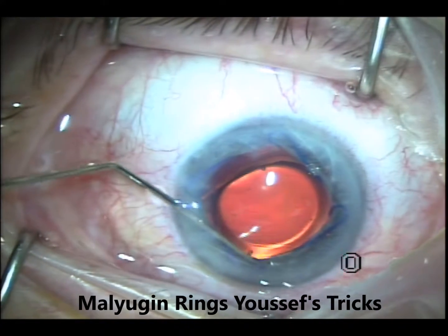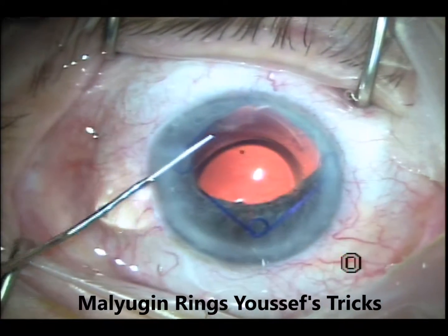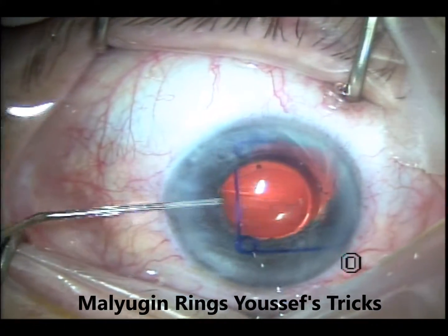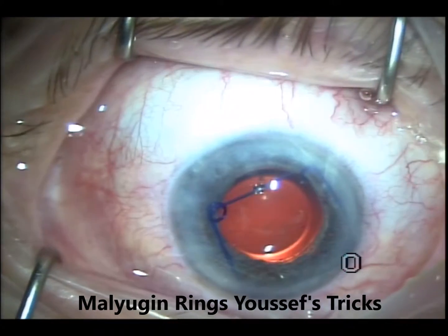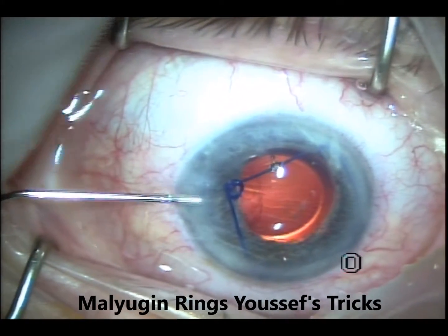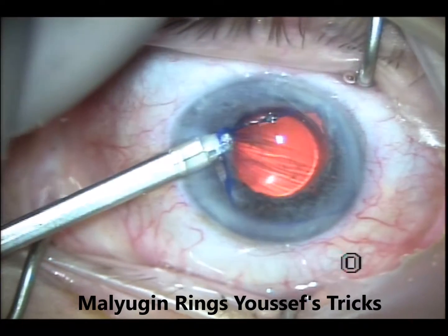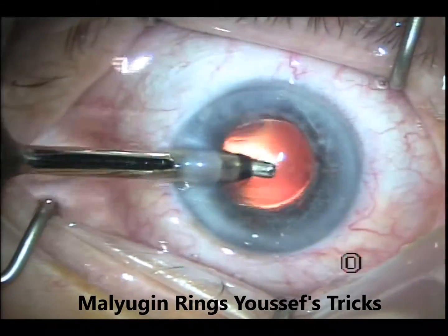Now I've implanted the lens. I use the Lester hook to implant and explant. The first one I'll disengage is the one on the right, and then I'll get into the bar between the temporal and the left scroll and push it away so that I can get the sub-incisional one away. Then I'll bring the superior one, the one on the left, into the incision. If the chamber is shallow, inject more viscoelastic to create more space so that you don't injure the cornea — engage and get that temporal scroll into the hub of the injector and remove it.